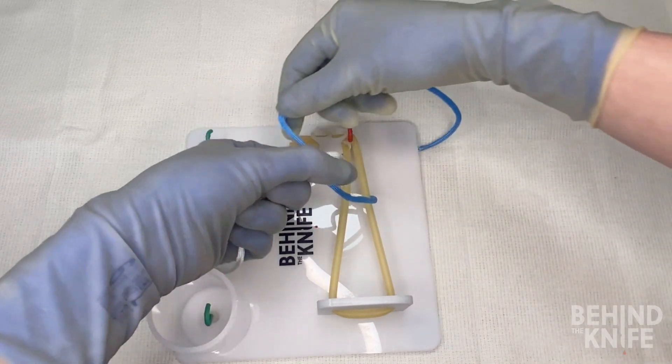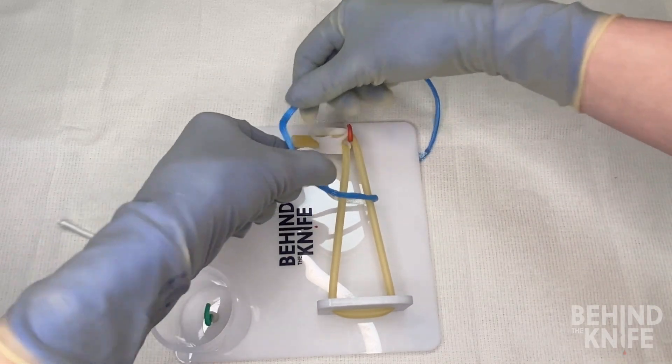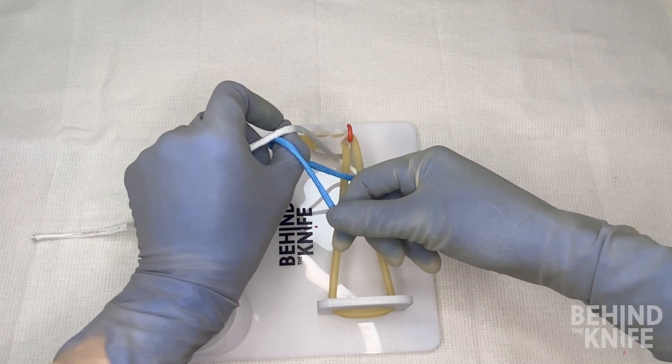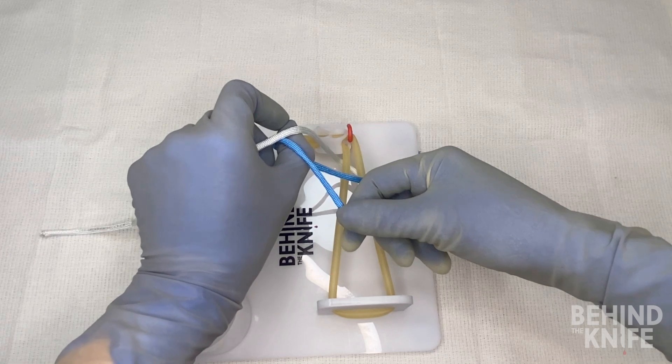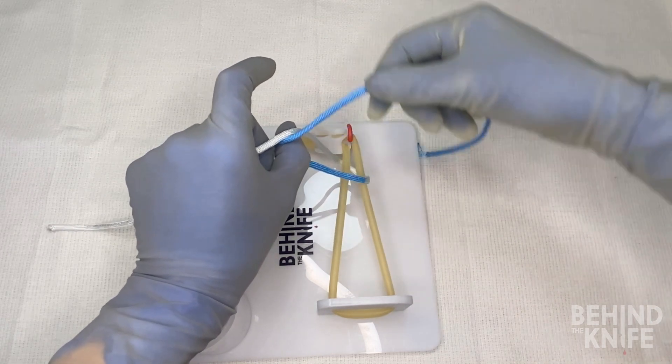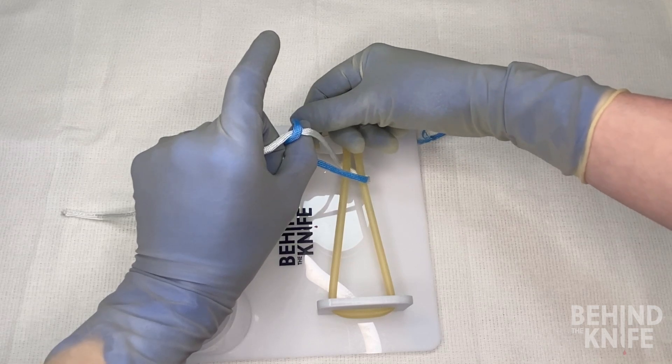Once again, we'll rotate our hands through with our index finger on top and our thumb on the bottom. We can unpinch our index finger and our thumb, and we can use our right hand to drape the blue end of our string over top our thumb.